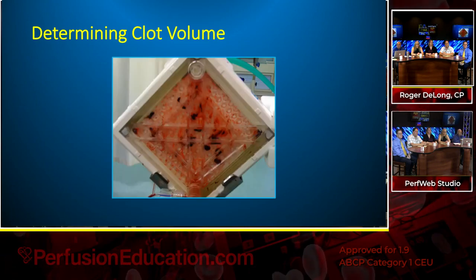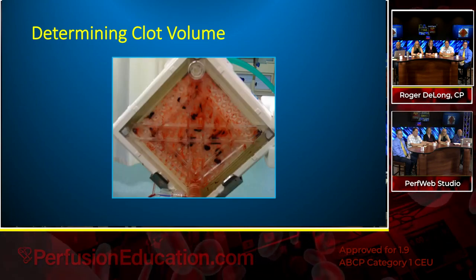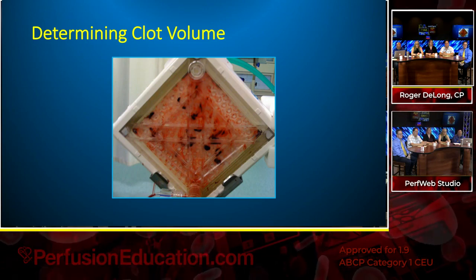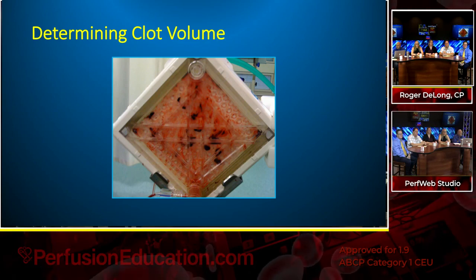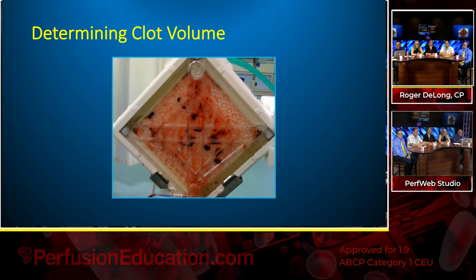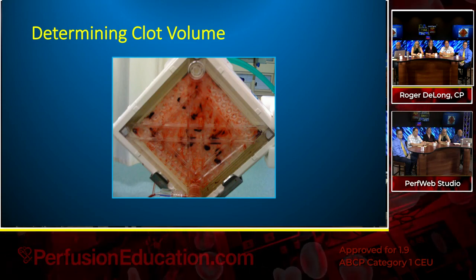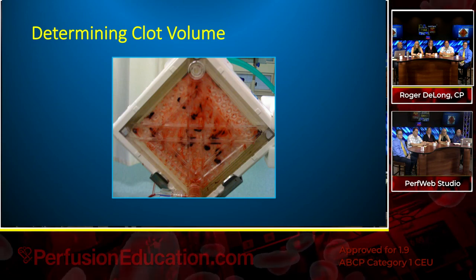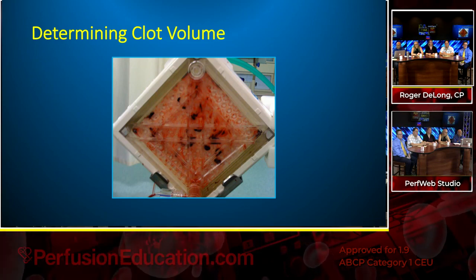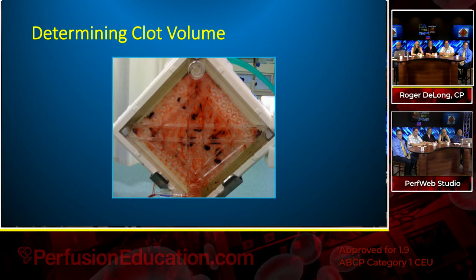Next one. All right, here you have something that looked very nice on the upstream side, but somewhere inside there's a large amount of clots that were growing through the fibers, and you can see the mature nodules, if you will, that were growing until the flow had enough surface area to knock it off, and then onto the patient it goes. Also with this, you can notice a lot of wide open fiber fields. There's no upstream indicator pressure-wise that this would be a problem. Next one.